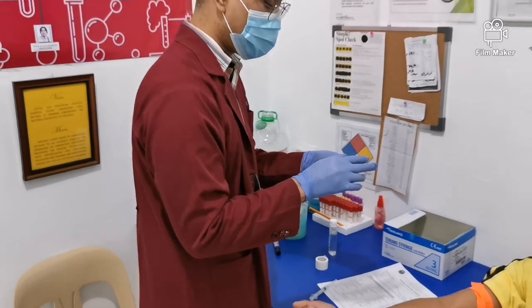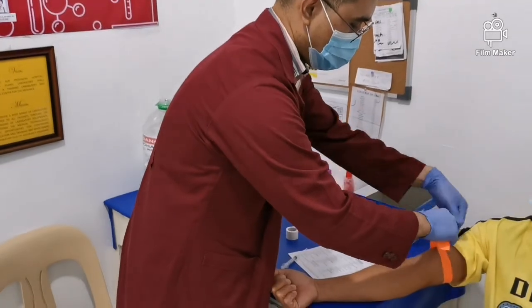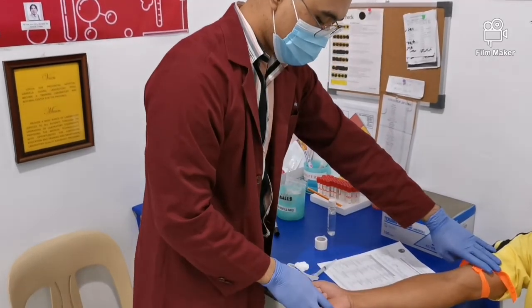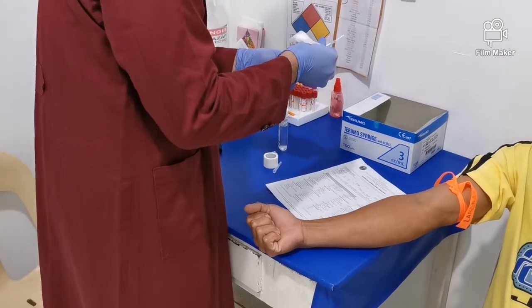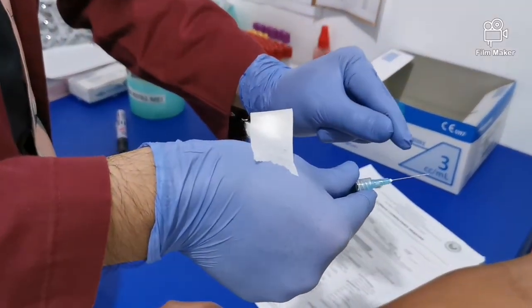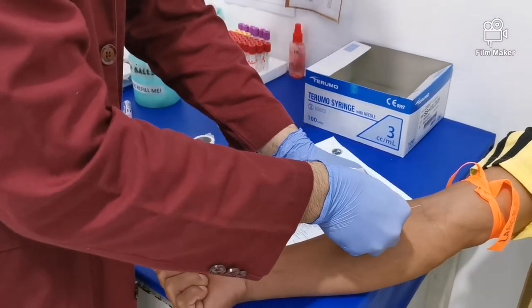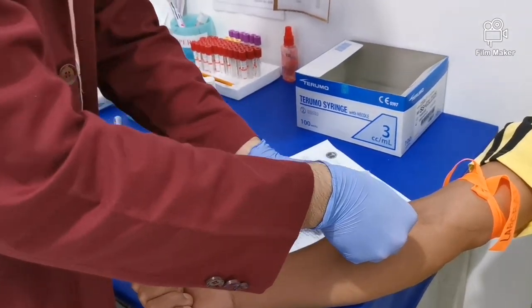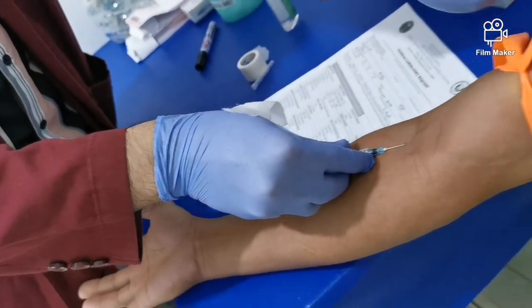And one thing pala, dapat kapag nag-extract kayo, kapag meron kang patient interaction, dapat naka-gloves kayo lagi. Okay? Tourniquet ulit. Close mo, sir. Bevel up, okay? Yung needle dapat naka-bevel up. Yung butas naka-taas. And then, proper angle. Sir, tusok ko na. Open mo na kamay mo, sir. And then, release the tourniquet first before you pull out the needle.